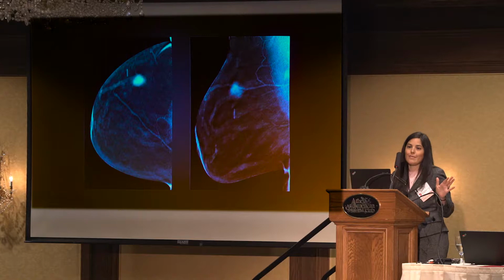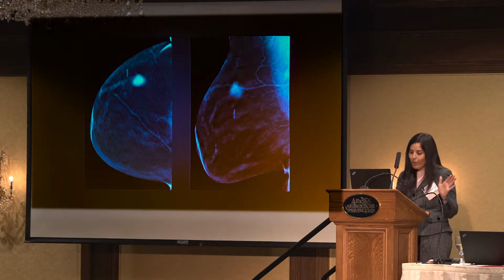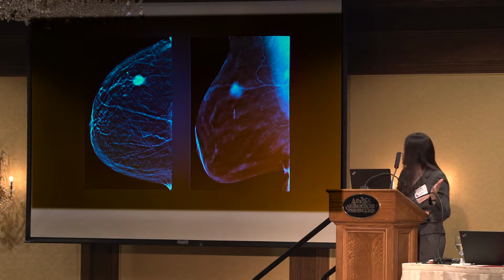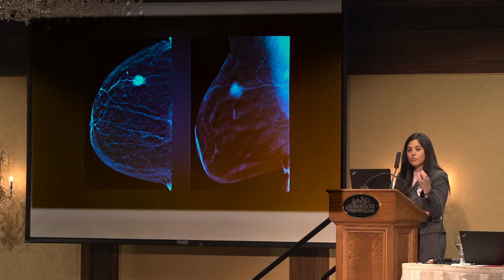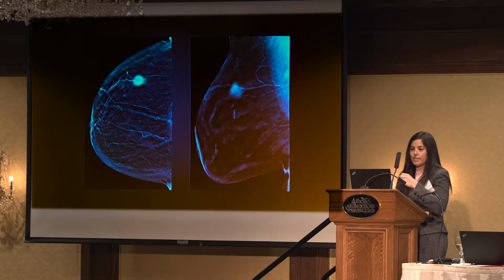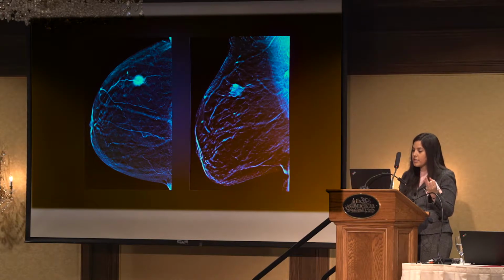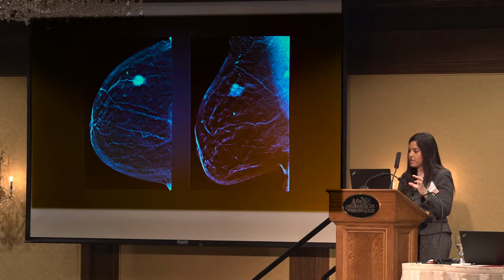So this is a real eye test, right? You're on the first slab and everybody can already see the cancer. But I think this case illustrates the point that it's not hard to see the cancer, but where tomo shines is that it really helps you define lesion margins. You don't need spot views. You can measure tumor extent. You can really see those spicules.